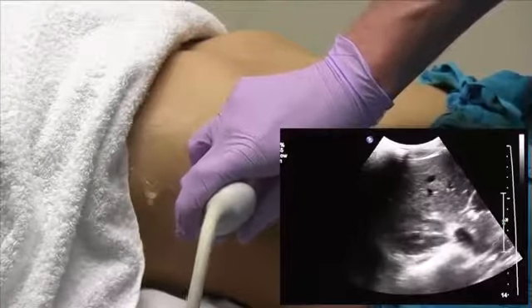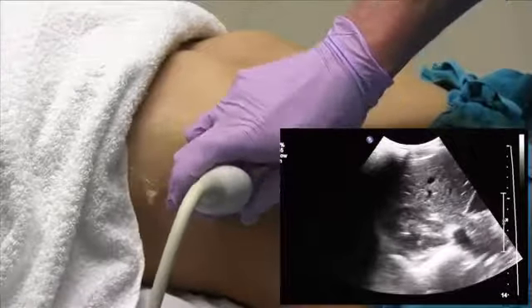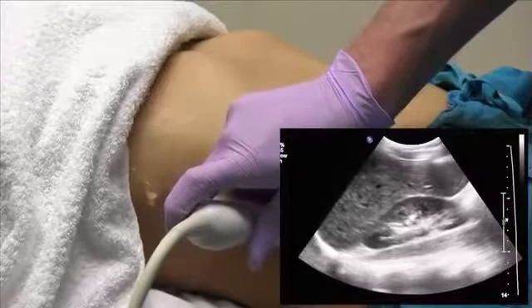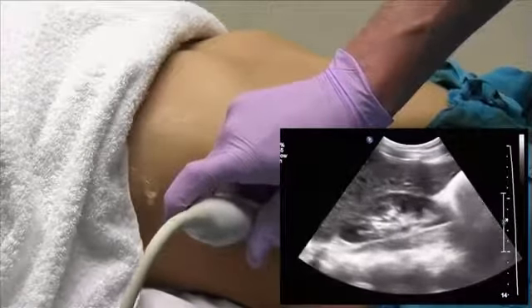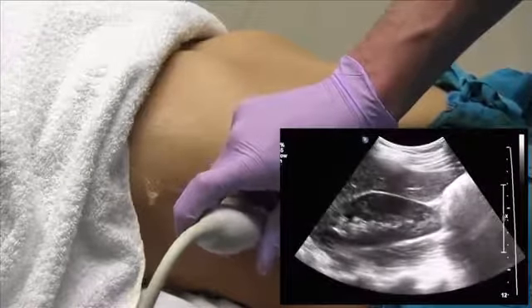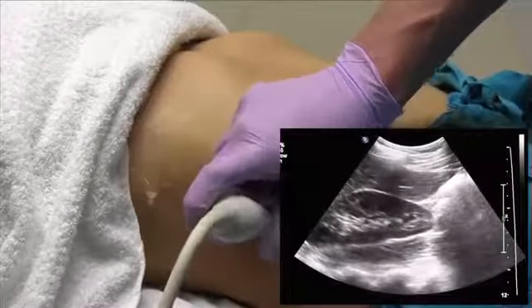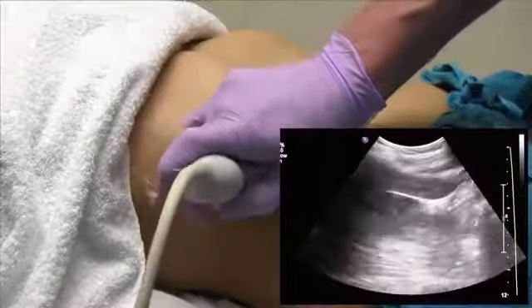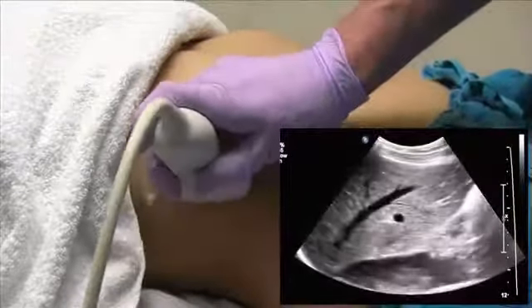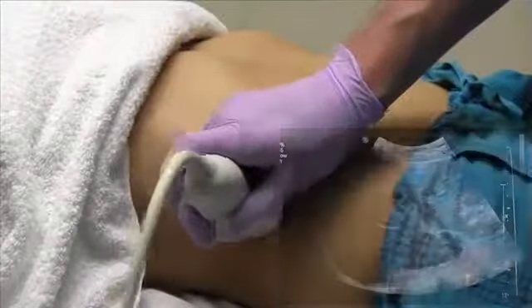From here, you can kind of judge the echogenicity of the liver and the kidney. And then, as you turn coronal, you'll be able to evaluate if there's any liver enlargement. The right kidney and the liver tip should both end at about the same spot. The whole time you're going to want to make sure that you're sweeping through the liver completely, just again to make sure you're not missing any pathology here.